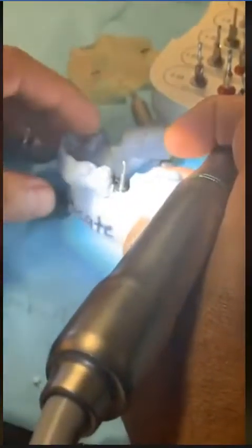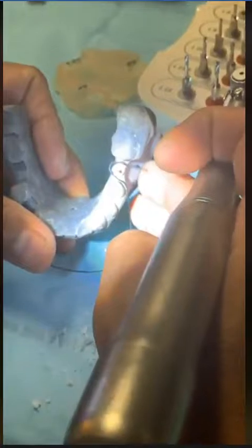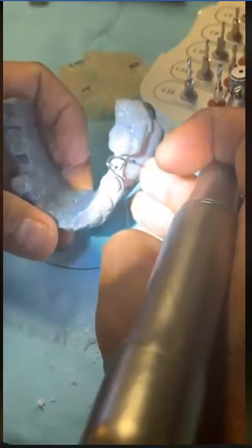Okay? If it's too cumbersome, then you don't have to worry about it. You could just remove it and put it in there, and probably do this side. Take a look. Okay, it's pretty good. We are where we want it to be, right?